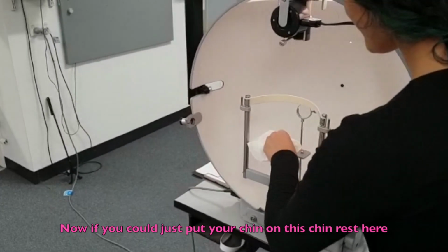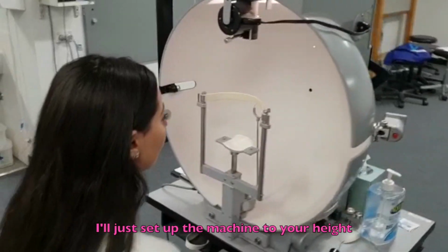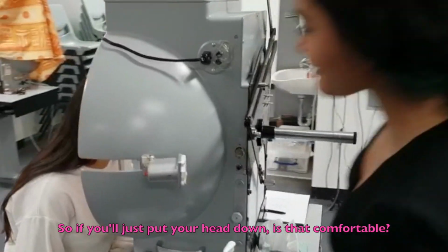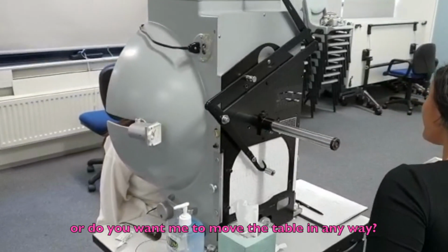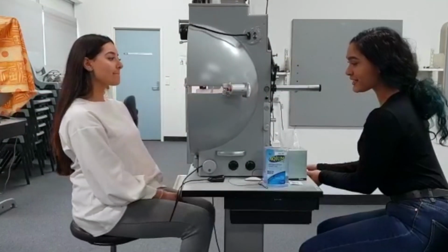If you could just put your chin on this chin rest and the head on the headrest, and I'll just set up the machine to your height. Yep. So if you could just put your head down, is it comfortable or do you want the table any higher? Just a bit higher. A bit higher? If you could just sit back for me, we'll just adjust the table.